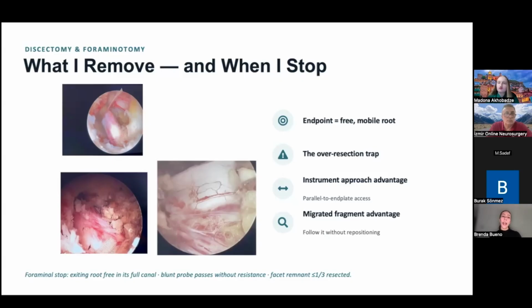So don't be afraid to do really thorough bone work, because sometimes, specifically in the facet, which you can assess before you start the surgery, it is hypertrophic, so there is too much bone. Sometimes what I do, like you saw before, is measure my facet and the bone work that I do. My drill is 4 millimeters. So I think, okay, if my decompression is 6 millimeters, my drill is 2 more millimeters. And I keep in mind how much I work.